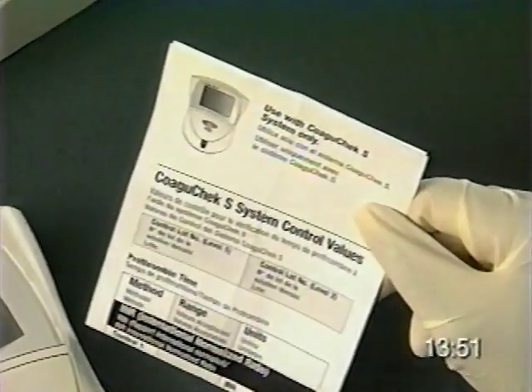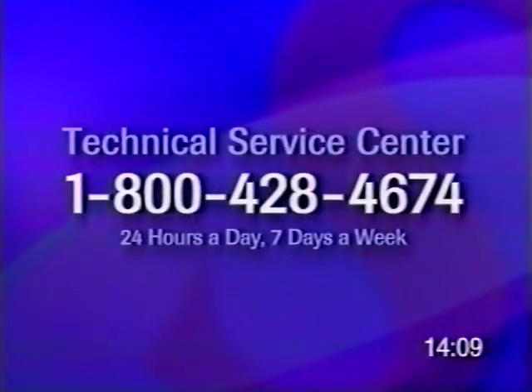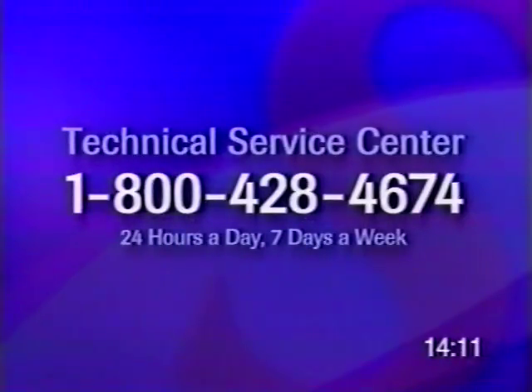I compare the result with the control value sheet from the box. Then I run the Level 2 control the same way with a new test strip. If a quality control result is out of range, you should retest with a new test strip and a new control. If repeated tests are out of range, then you should call the Roche Diagnostics Technical Service Center.